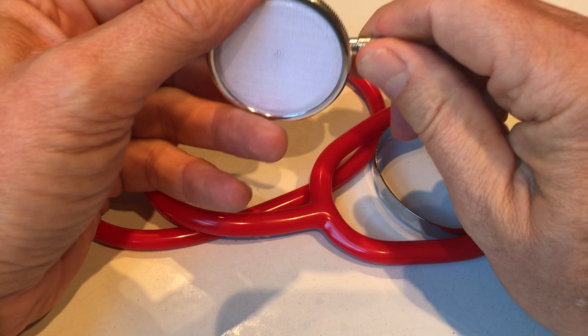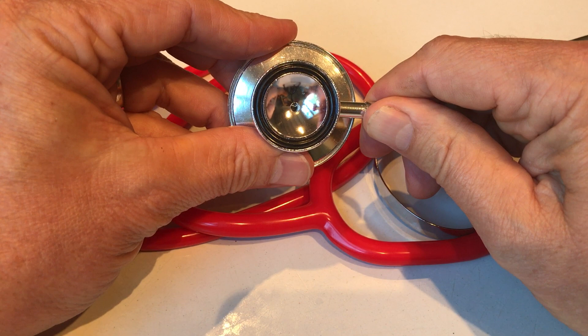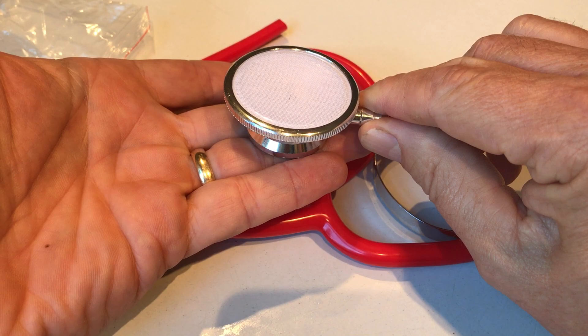To select which side you're going to listen through, the whole chest piece rotates. You can see me holding the central bevel — you might just hear that clicking as it locks into place. If you look through here you can see the lumen opening and then closing as I adjust it. That's got to be in the right alignment to use it. So this is the alignment now for it to be placed on the skin for auscultation.